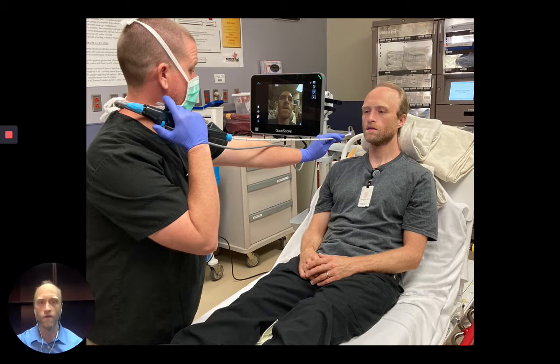So before inserting your scope, you want to ensure that your patient is also positioned appropriately and that you are comfortable. If possible, have your patient sitting up to close to 90 degrees and in the ear to sternal notch position to optimize airway alignment. Ensure that the screen is arranged to maximize your comfort. Position yourself to keep the flexible endoscope midline and straight. It is preferred to have the right hand high to maneuver the lever and the left hand low to guide the scope. Keeping the scope straight will help you direct it.